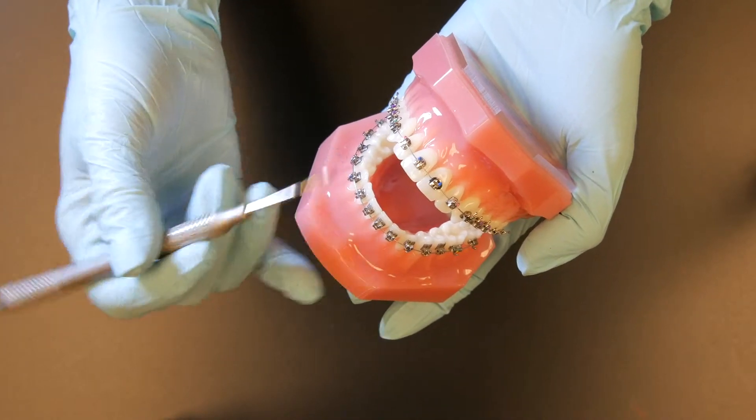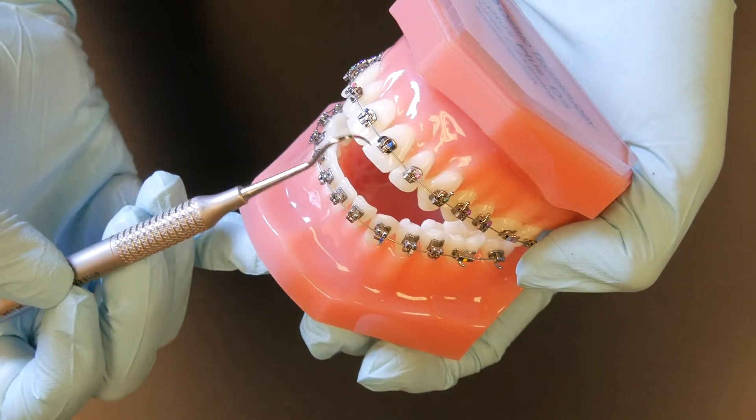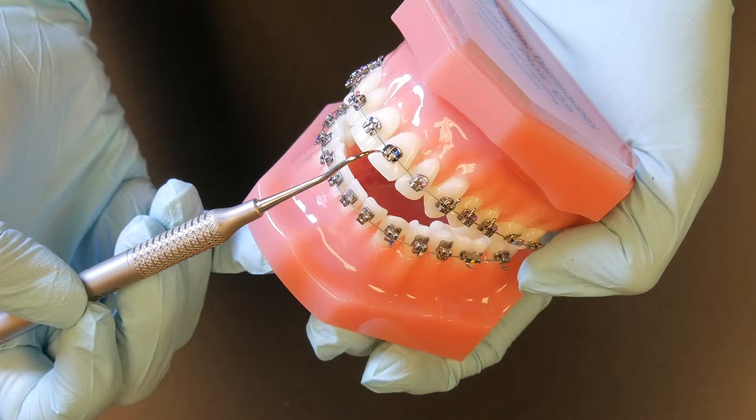It is a one-piece bracket and it has a low profile for patient comfort. It is a familiar twin wing design so that elastic tie ligation can be used if needed.